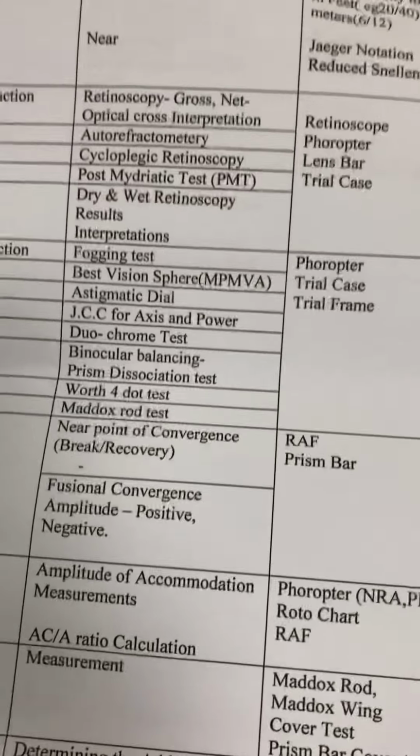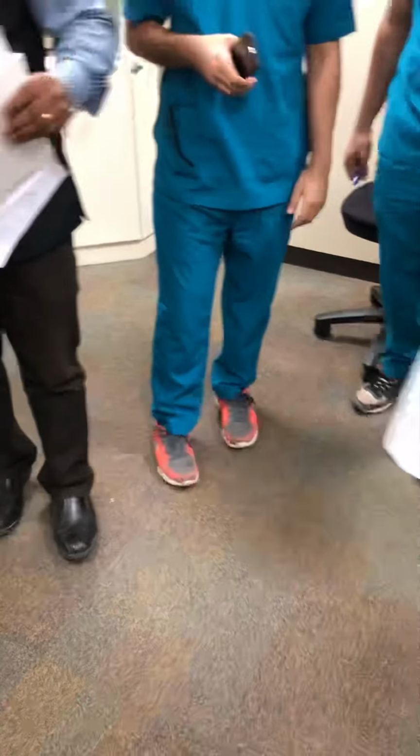And the bold one, the last one, is the average of these 4 readings. So 1, 2, 3, 4 readings and then the average here. And the PD is here, the pupil distance. Yes, PD is here.